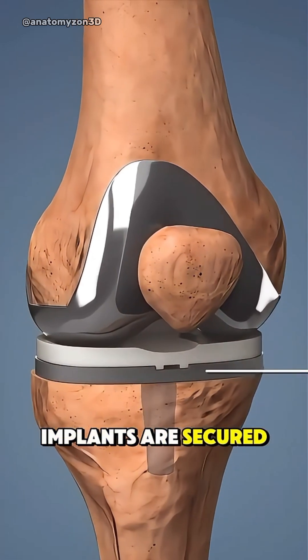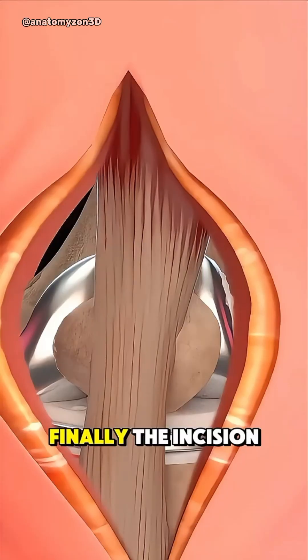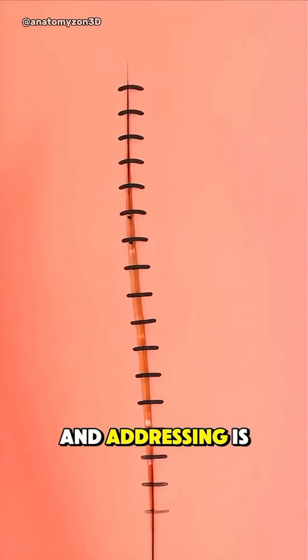Once the implants are secured, the knee is tested for smooth motion and alignment. Finally, the incision is closed with sutures or staples and a dressing is applied.